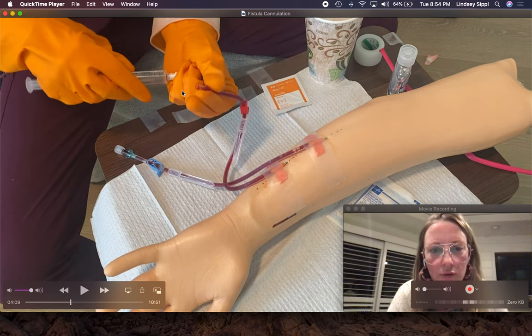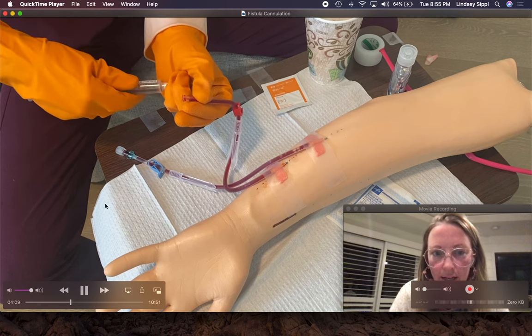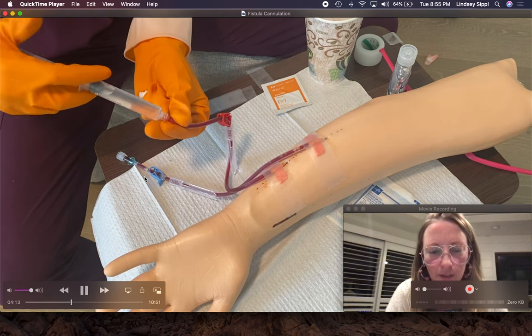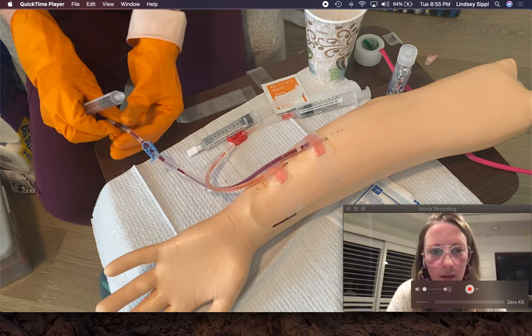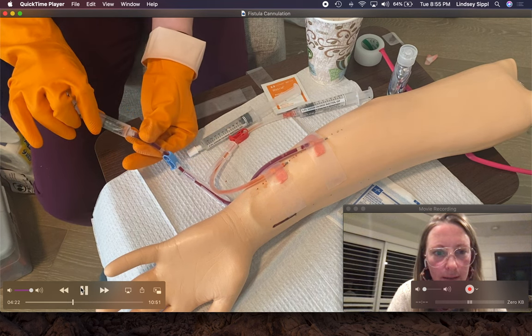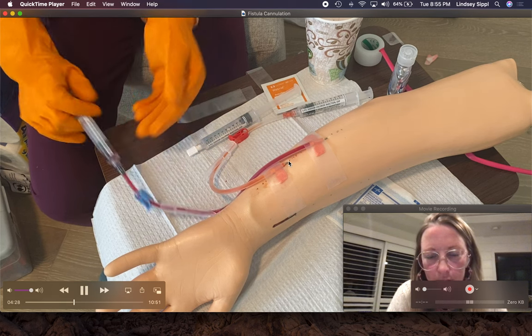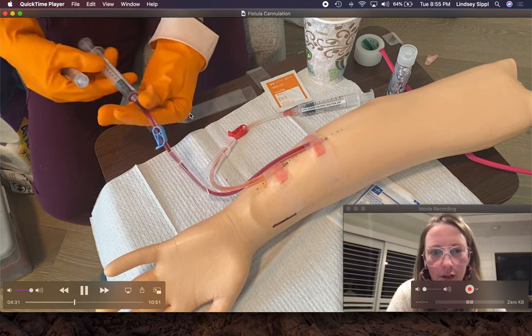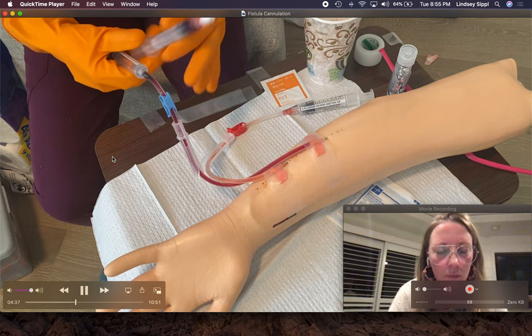Next I'm going to flush this needle with saline. If at any point you're having trouble with one of the needles, it is good practice to flush the other needle, because patients can get a clot at the tip of that needle if the blood is just sitting there stagnant — otherwise you have to recannulate and that's no fun. I have an empty syringe here, I'm going to pull back — pulls back easy, I know I'm in the fistula. I'm going to push that blood back in and do the saline flush.